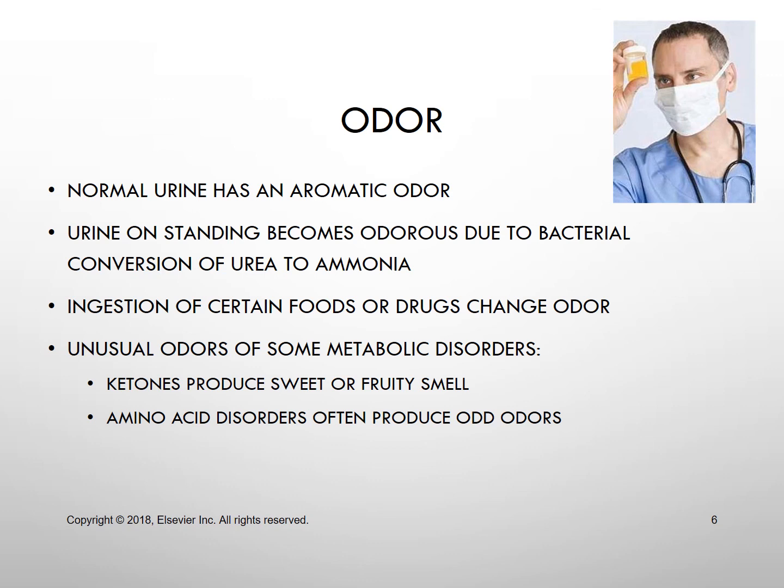Certain ingested foods can cause urine to have a noticeable odor, such as asparagus, or certain types of IV medication where you have a distinct type of aroma. Some metabolic diseases may produce an aromatic, sweet or fruity smelling urine. In some of these conditions, most commonly diabetes, glucose is present and cannot be used by the body, so fat is metabolized as compensation. So here you can have a sweet smelling urine.